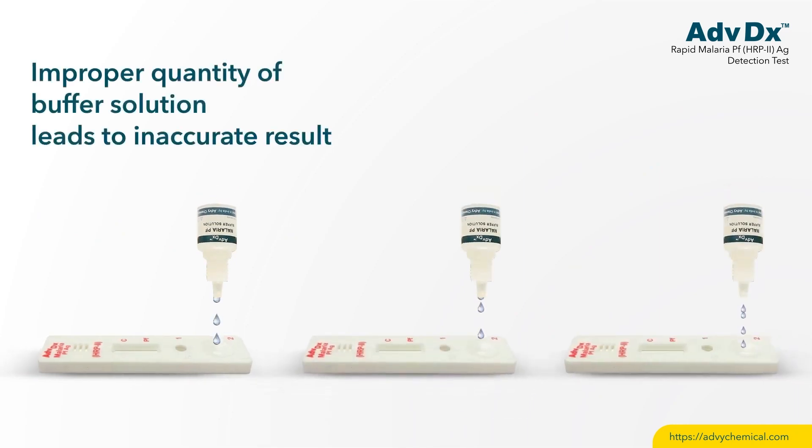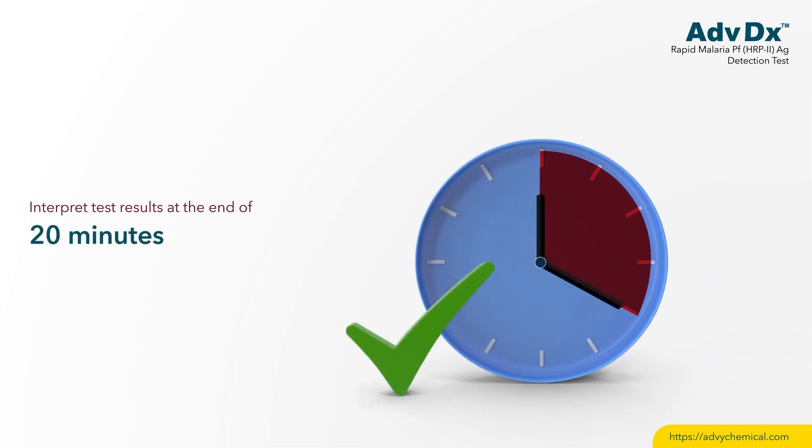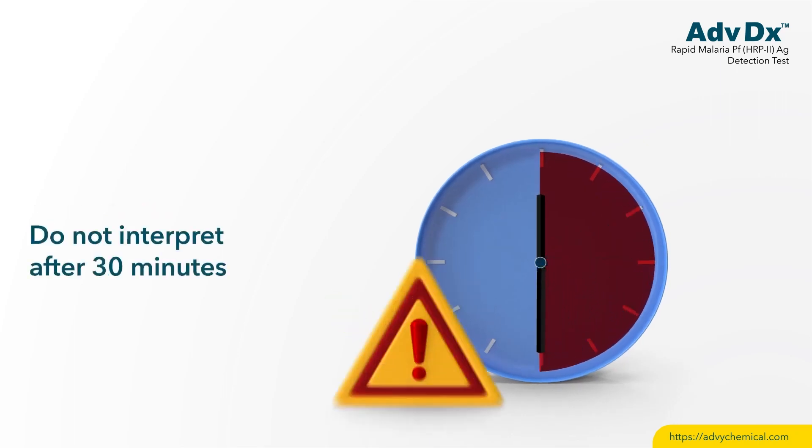Improper quantity of buffer solution leads to an inaccurate result. Interpret test results at the end of 20 minutes. Do not interpret after 30 minutes.